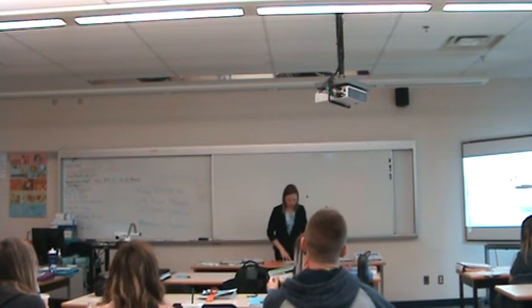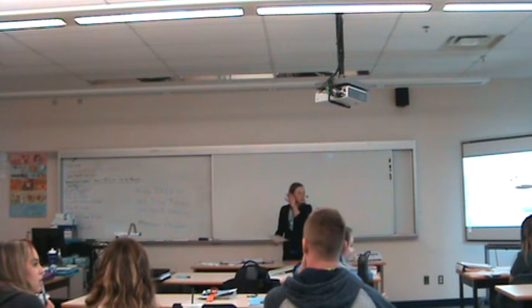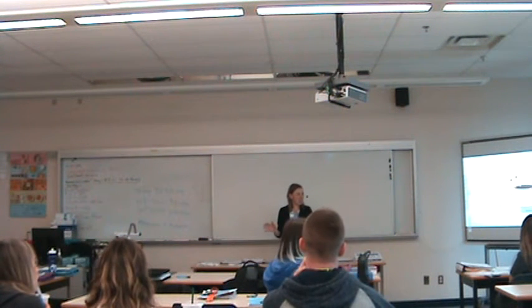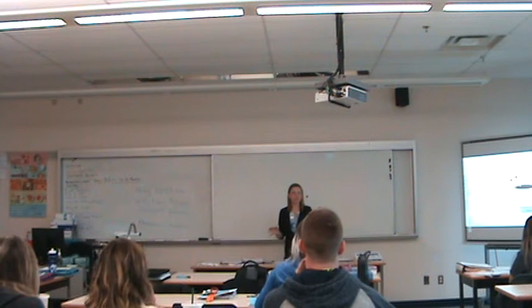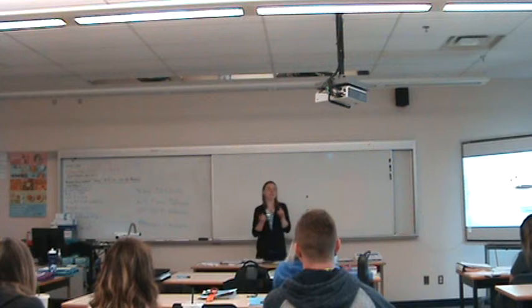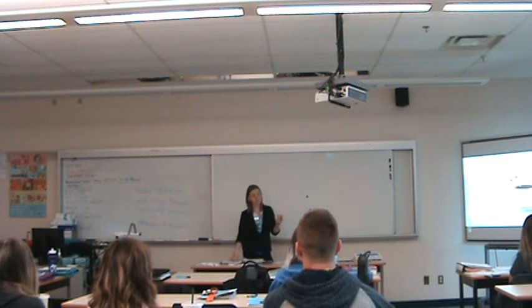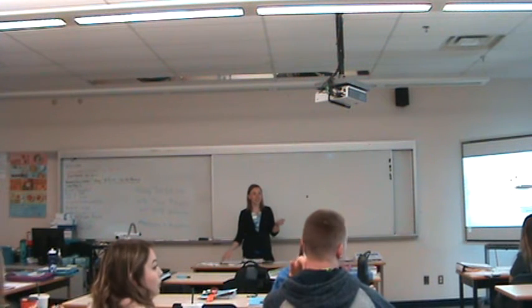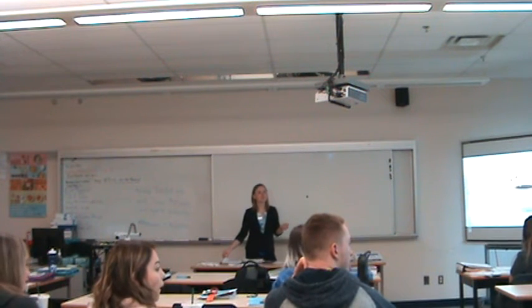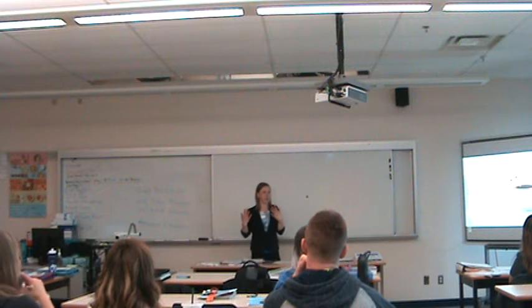Okay, let's go over this thing here. How about we talk about everything that we did today. Any questions to start? No? So what kind of stuff did we discuss? Retainers, fixed appliances. Passive, active. People have expanders and appliances with braces as well. Sometimes, yeah. What we'll do is the expansion first, and then the braces, and the expander is just holding everything.